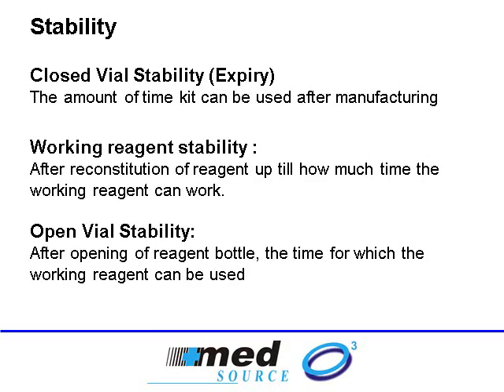A more important concept is the concept of stability. Stability can be of three types. A, the expiry, which is the time in which the kit can be used from the date of manufacture.